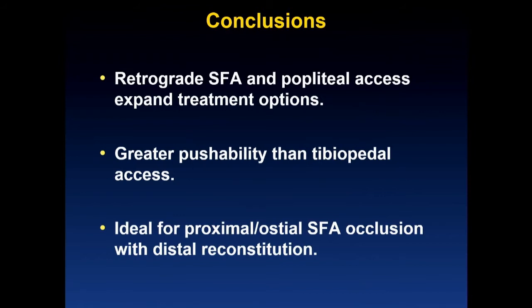In conclusion, retrograde SFA and popliteal access, I think, really do help expand the treatment options for patients with complex superficial femoral artery disease. I think there's been a lot of focus on tibiopedal and extreme access, but the reality is if you look at a lot of literature, even for complex SFAs, there does remain a certain failure rate of procedural success. If you start adding retrograde SFA and popliteal access to your toolbox, the success rates for even the most complex SFA occlusions are nearing 100%.